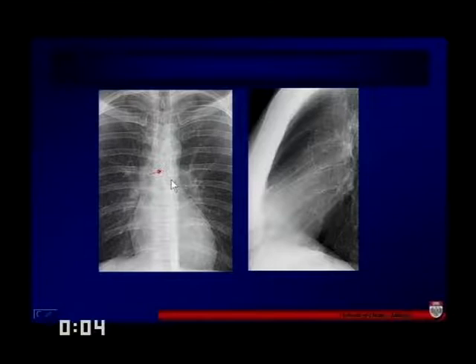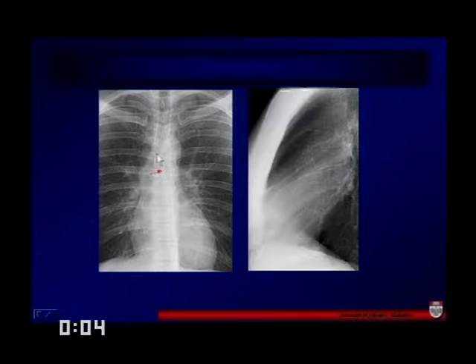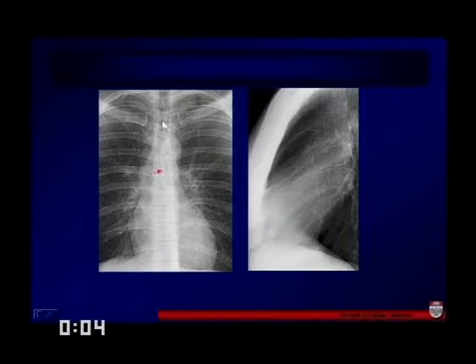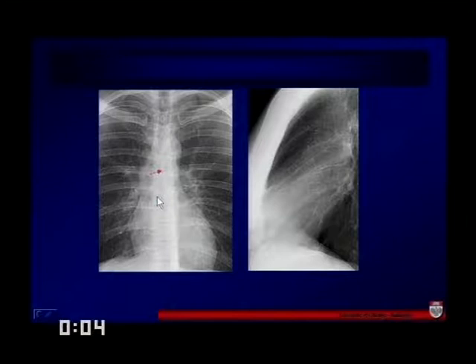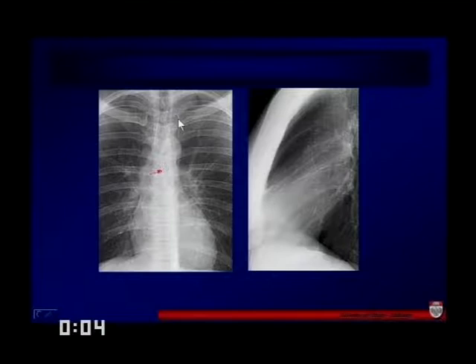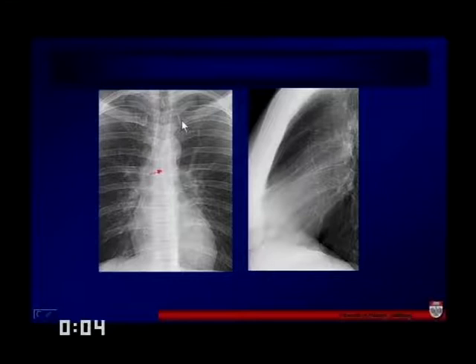We should also be able to see a very thin right paratracheal stripe. This is what's called the supra-azygous area, and this is the infra-azygous area, or azygoesophageal recess. Normal junction lines and reflections should allow us to see whether there's actually a tumor or any other kind of pathology going on.